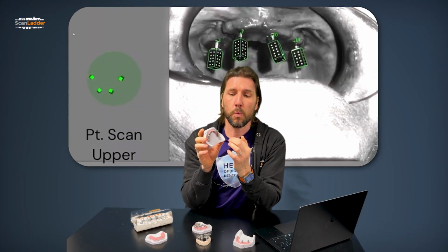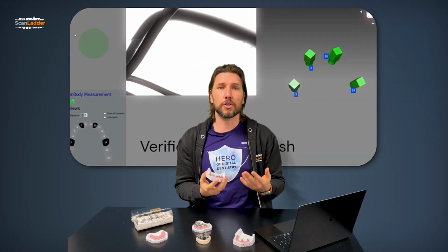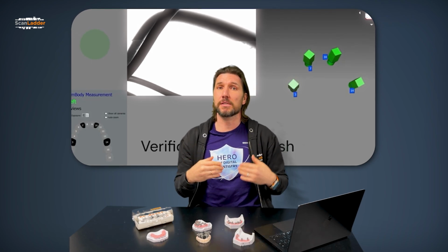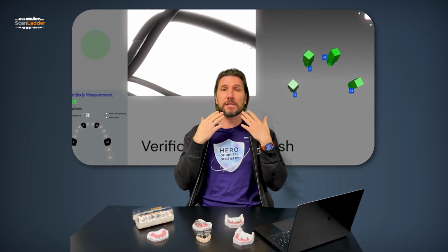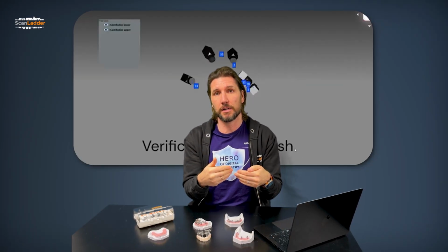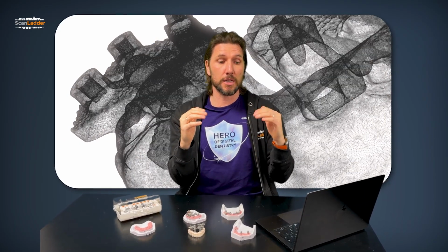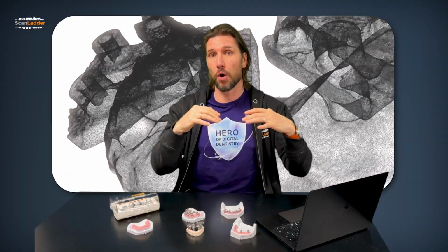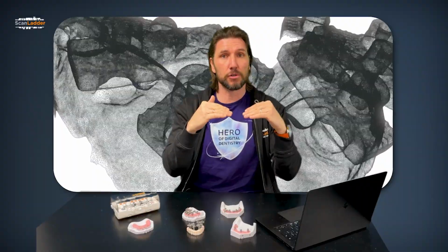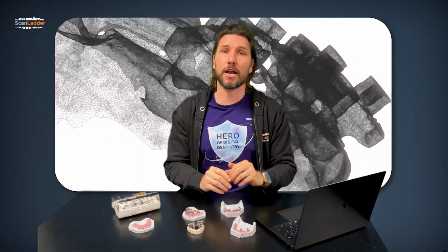So why is this appropriate in some situations? Well, if you think about the tongue can get in the way, the tongue can be of different strengths, pushing on scan bodies, the patient could be sedated, the lips could be in the way, and the tongue could be sitting really far forward. So it'd be impossible to fit everything centralized. The anatomy of the arch might be such that if the anatomy is really ovate or really opened out, the position of the implants might mean that those scan bodies are never going to centrally locate, then any system where it relies on that instantly cannot use them.